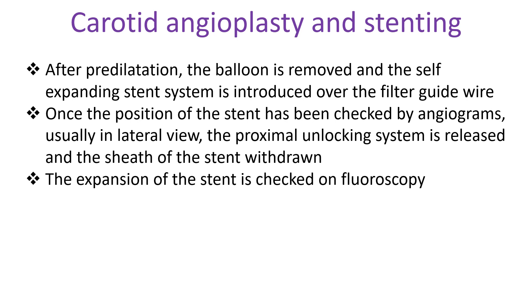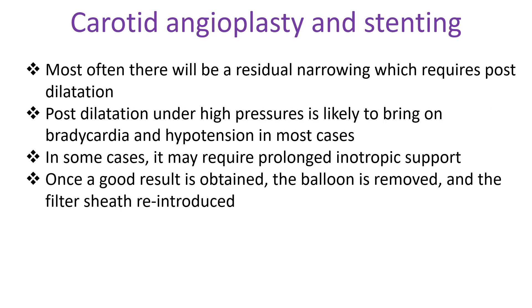After predilatation, the balloon is removed and the self-expanding stent system is introduced over the filter guide wire. Once the position of the stent has been checked by angiograms — usually in lateral view — the proximal unlocking system is released and the sheath of the stent withdrawn. The expansion of the stent is checked on fluoroscopy. Most often there will be a residual narrowing which requires post dilatation.